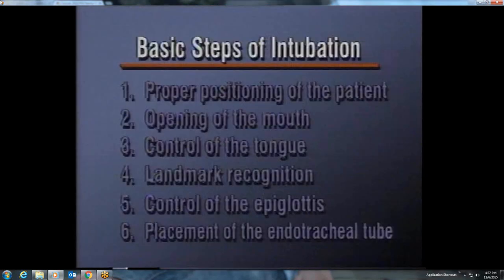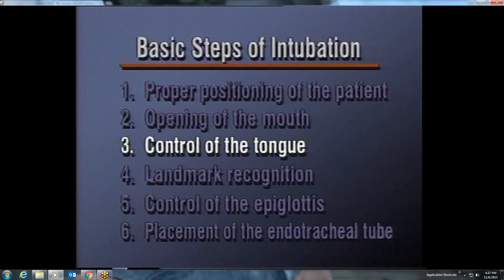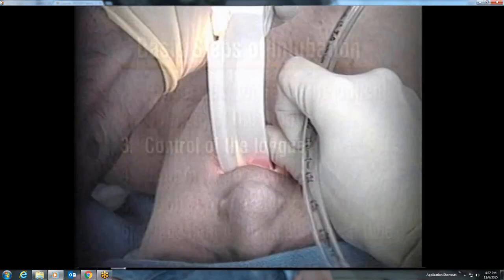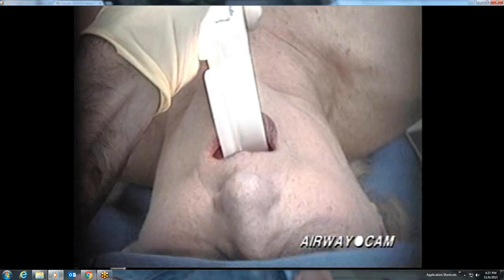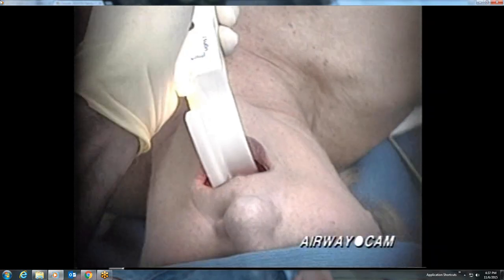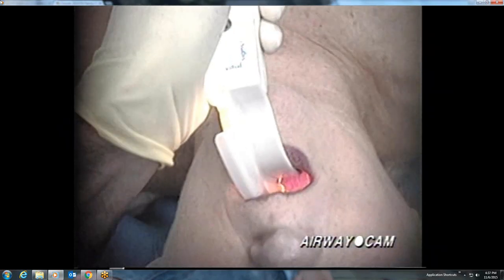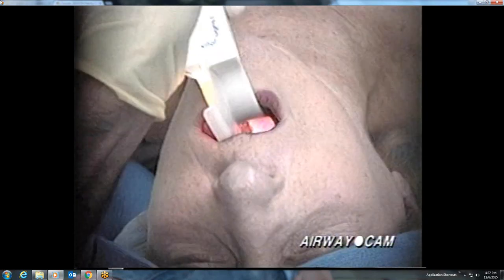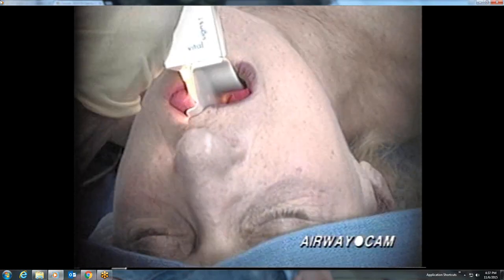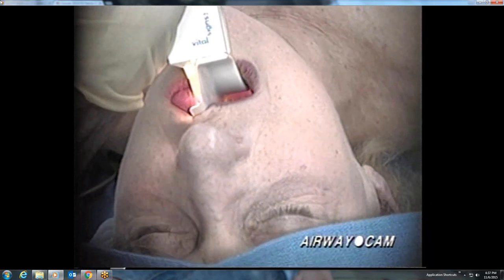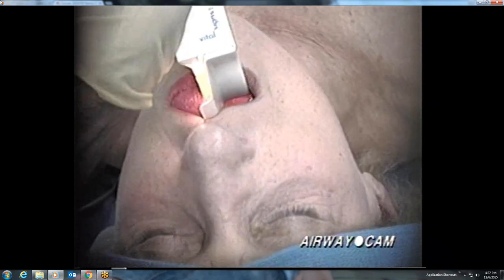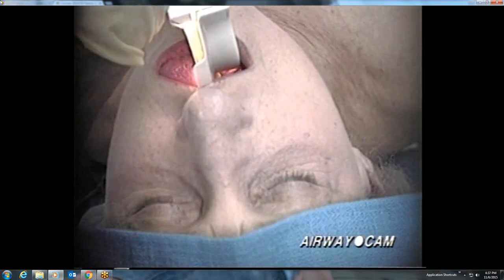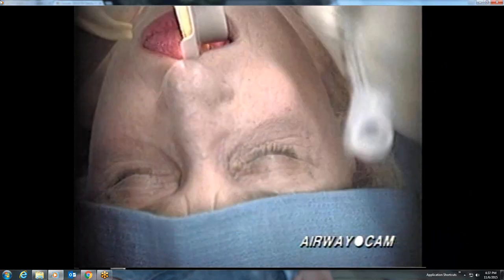The third step in orotracheal intubation is control of the tongue using the flange of the laryngoscope blade. The larger flange of the curved or Macintosh blade is easier for directing the tongue to the left side of the mouth than the smaller flange of the straight or Miller blade. Also, the curved blade has a natural fit with the curvature of the tongue and a natural stopping point in the vallecula at the base of the tongue and epiglottis.